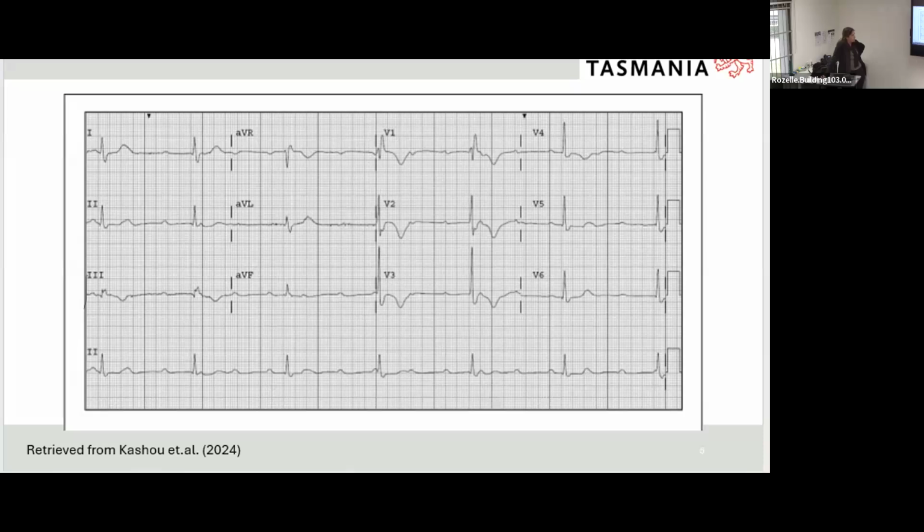So is anyone else in disagreement with that? Sorry, just to clarify, Anita, so if the P wave is regular and the QRS are regular, but they're not in sync, then it's an AV block. But if it's a third degree block, neither will be regular? So when you say AV block, there are different types, aren't there? There's first degree, there's second degree type 1, there's second degree type 2, and then there's third degree, which people use as complete AV block.